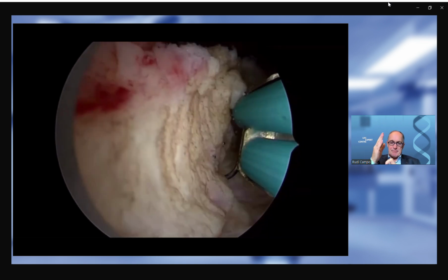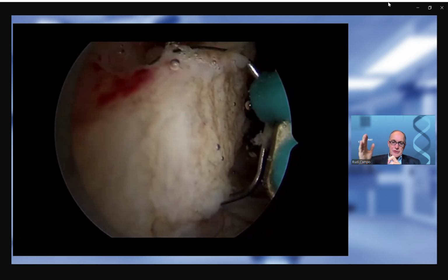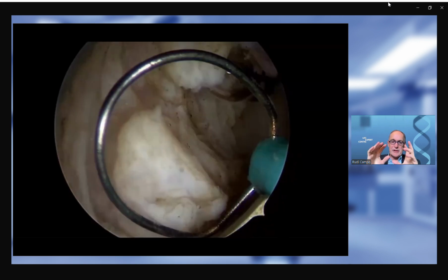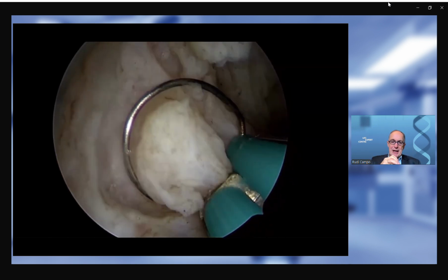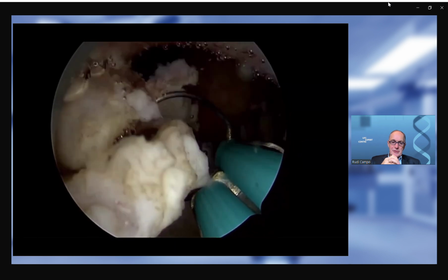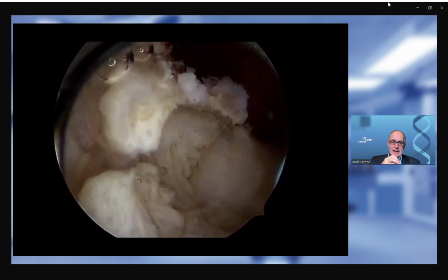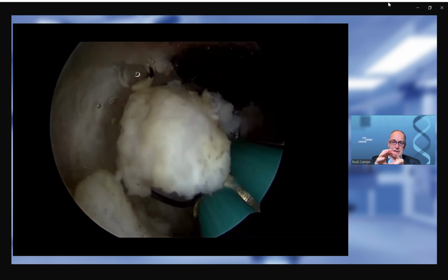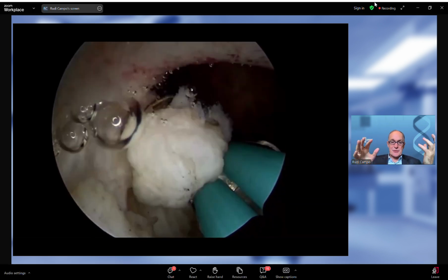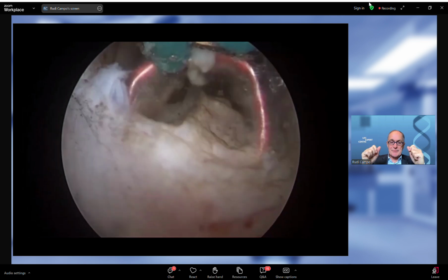Once you have done the midline, we go to the sidewall. And there it is only possible to do this with the mini bipolar resectoscope. Don't do it with another one. You kill the patient and yourself, and you find this plane of cleavage, which is not the real capsule. We cannot speak about capsule.